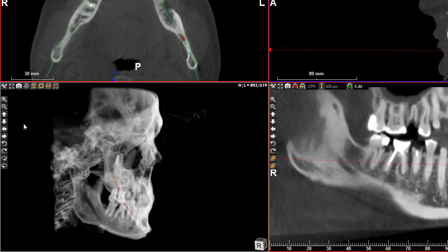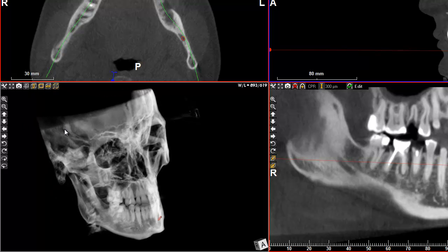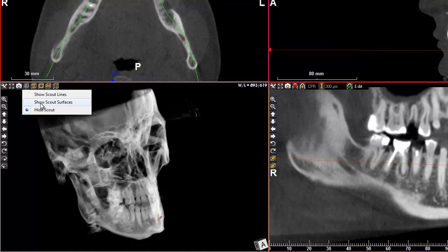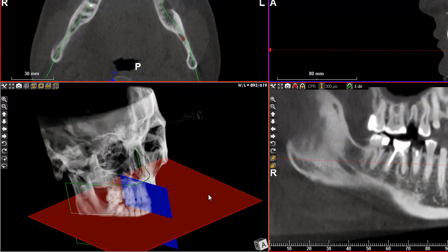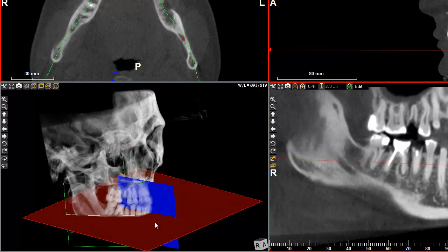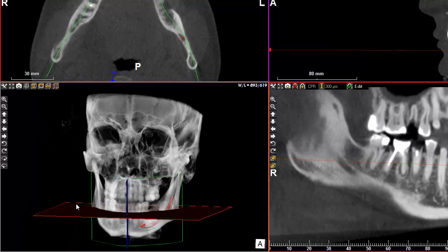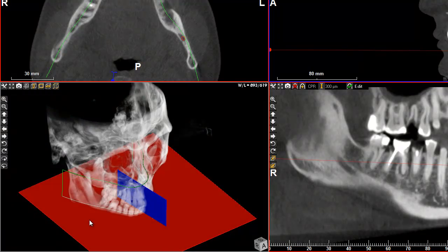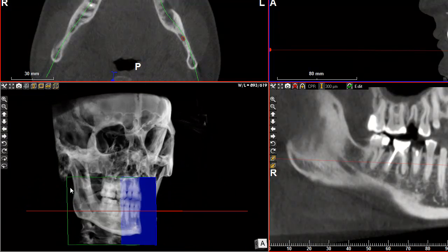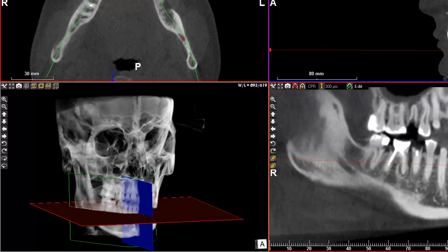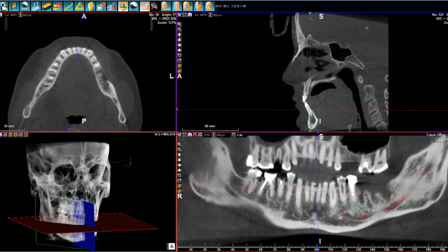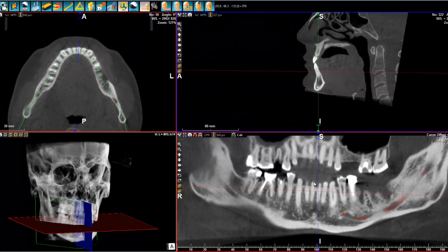Now we have another view — we have 3D. If we show the surfaces, you can see the green curve is exactly the curve of my panoramic, and it's like a sheet of paper that has been folded to create an image. This is quite an interesting image already and can be good enough to do some diagnostics and get a good idea of the dentition of your patient.